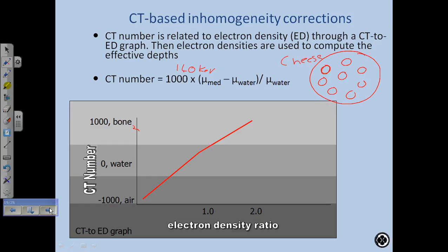So that's the question. Now, it's a little more difficult to plan from a high energy CT scan, because the high energy CT image is not as good quality as a low energy image. Because of the higher energy, there's less contrast. You know what I mean by higher energy CT scan? The tomotherapy unit has the ability to do a CT scan of the patient, but they use an energy that's, when they treat in tomotherapy, it's 6 MeV. Okay, but they could detune that LINAC to bring it down to approximately a 3 MeV beam. So they detune it to get the CT scan. The lower they can get the energy, the higher quality the picture will be, because there's more photoelectric effect, which gives you more contrast.